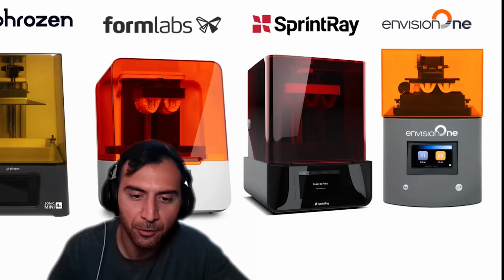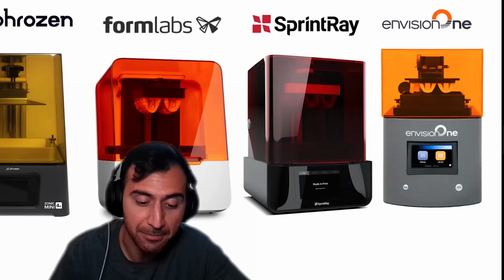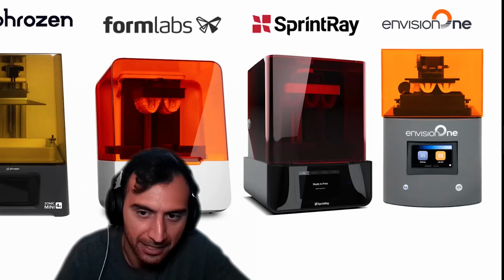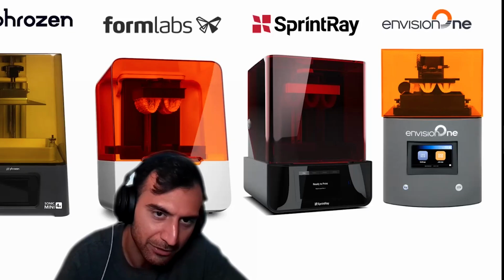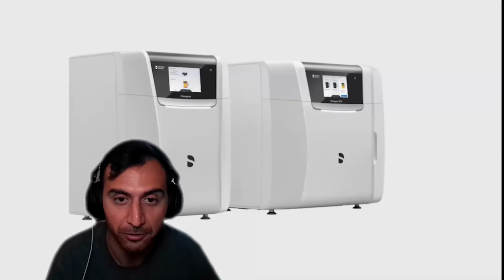I would say most of you would fall into that middle range because I delegate these tasks, and I delegate most tasks. If you really want to get a good system down, you want to delegate. You're going to have an easier time delegating those middle tier printers versus an Amazon printer. But there's people talented enough. So you know your staff and you work with what you got.